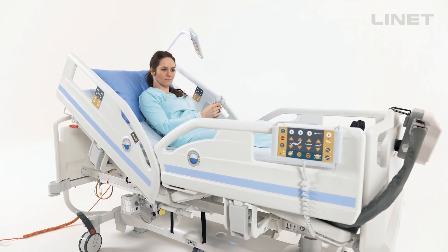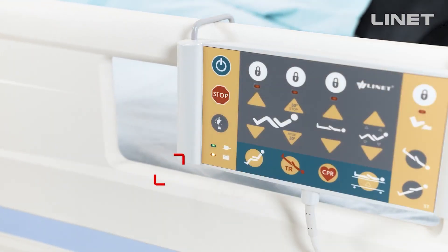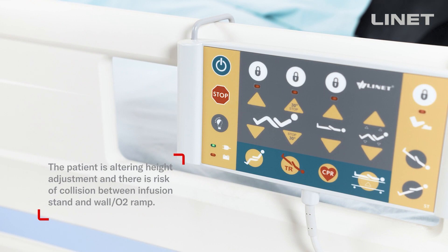To stop any unintentional movement, just use the stop button located on the accessory control panel.